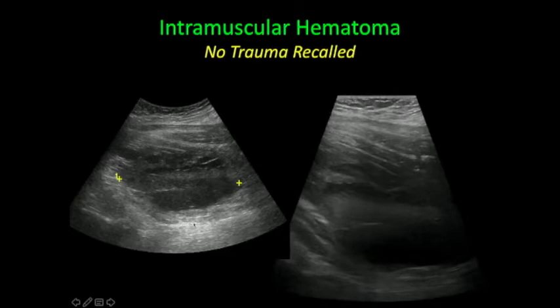This was a hematoma that was incidentally seen in a patient for a DVT study, and you can see this is a hematoma that's probably subacute, looking at its appearance, so it's got layering of the different parts of the fluid as the elements are settling out.